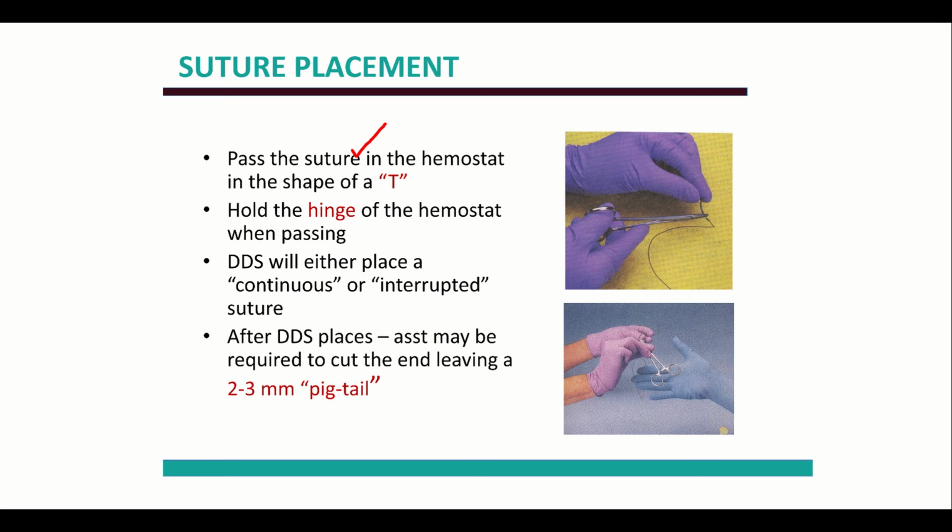Now, one of your jobs during this procedure, besides passing the hemostat and making sure to pass it correctly, will be, once they are passed and the doctor has placed the suture, you might need to cut off the end of that suture. Again, this has historically been a question on the RDA exam: leave the pigtail that remains, or the little bit of suture thread hanging out of the mouth, about 2 to 3 millimeters, not inches, millimeters, and then we cut it off there. You don't want it too long, so the patient will play with the end, or too short, where the knot will unravel.